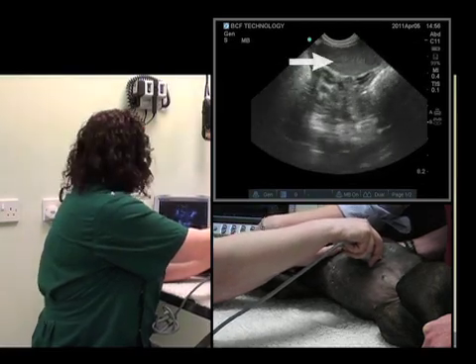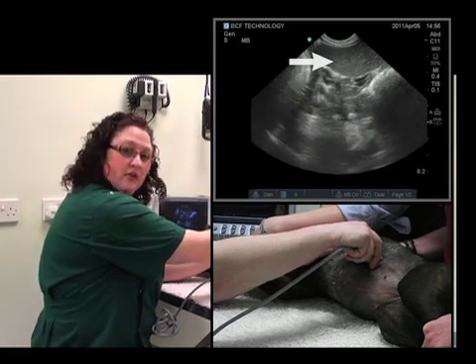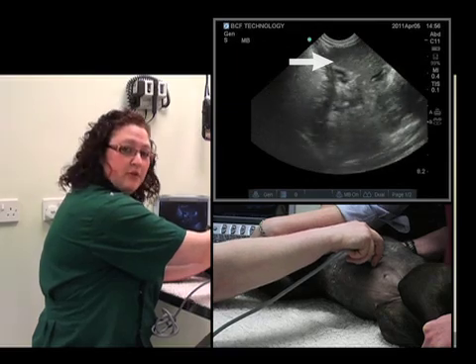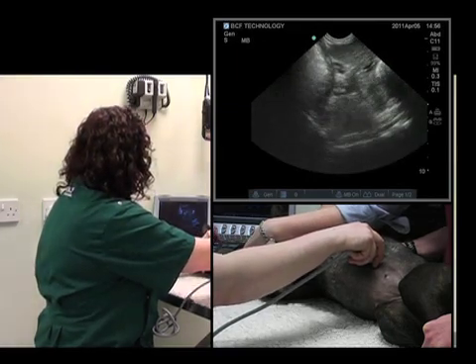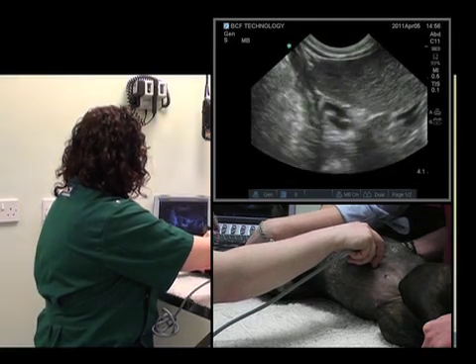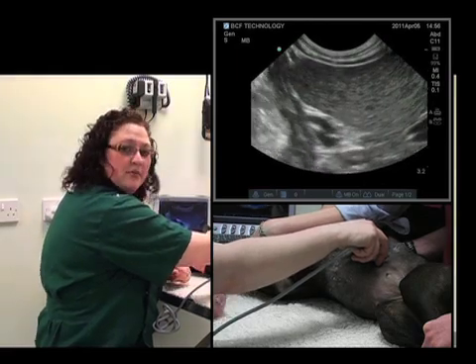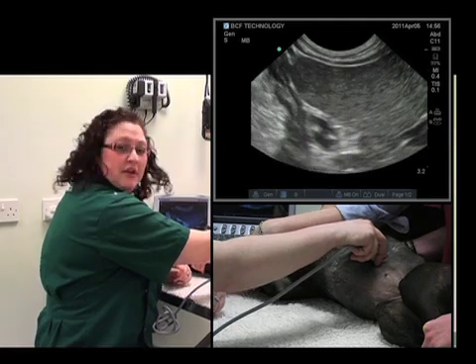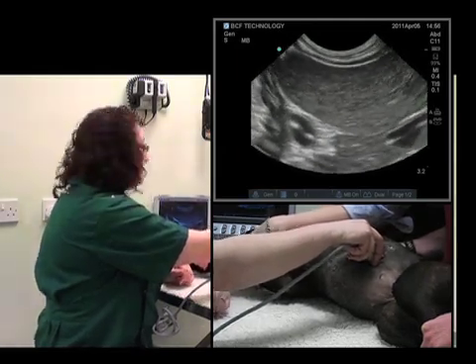There it is at the top of the screen. What I now need to do is alter the overall gain, the time gain compensation, and the depth appropriately. We'll start with depth, and that's occupying about three quarters of the screen. Looking at overall gain and time gain compensation, it looks pretty good, so we'll leave those alone.